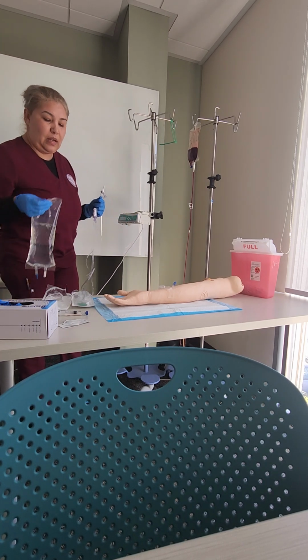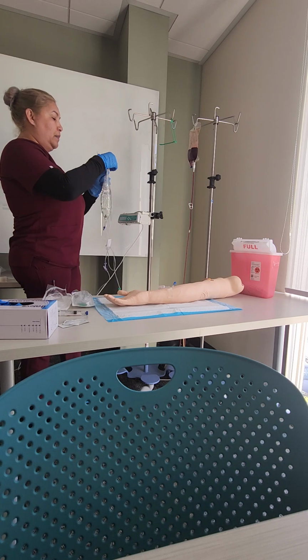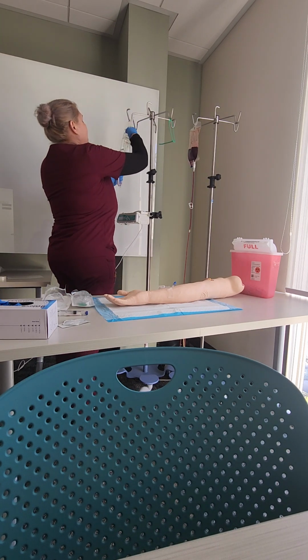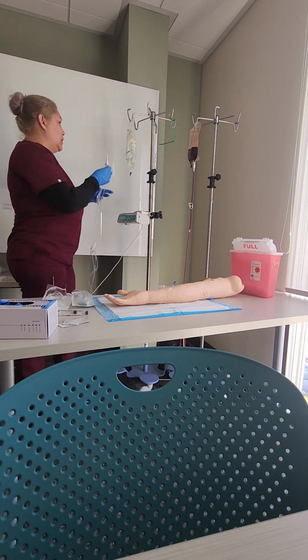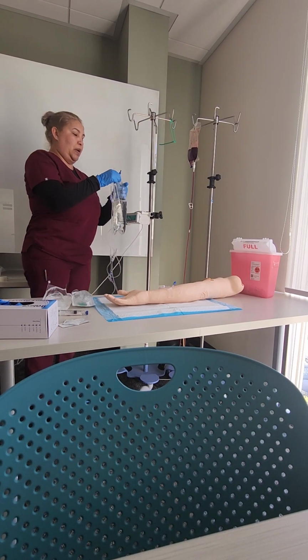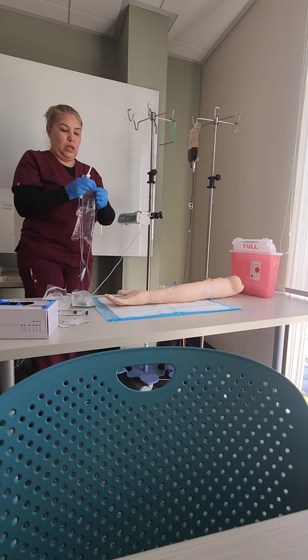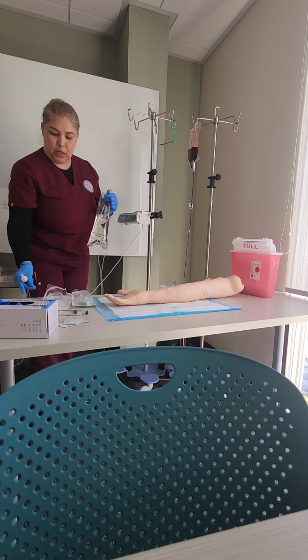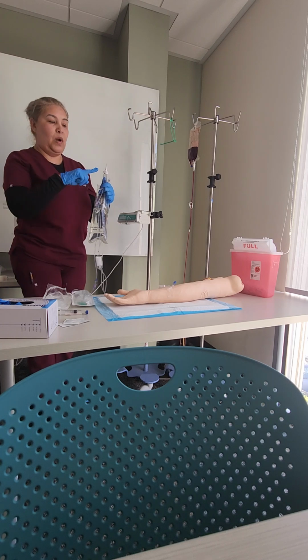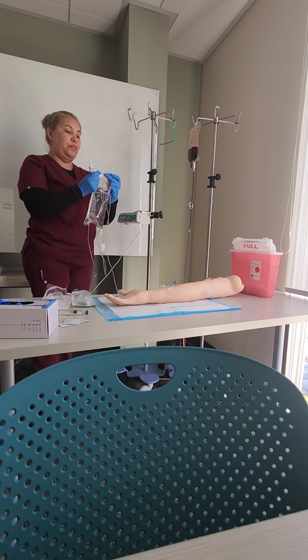I want to hang my first bag. And I want to be talking to the patient while I do this process. Actually, what I will do, just so that it doesn't drip, I'm going to open up my bag. I do not want to touch this because it is sterile.